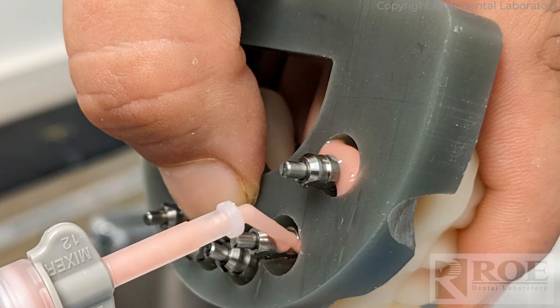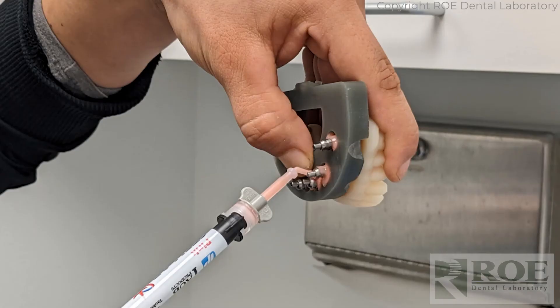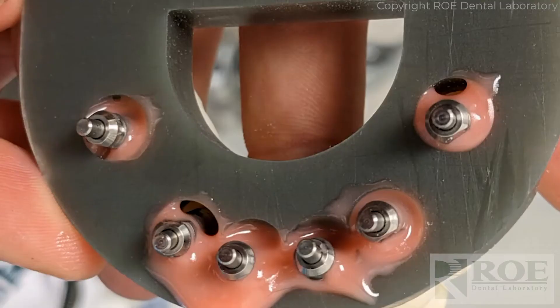With small hole technology, we take the prosthetic back to the lab, add the C2F analogs onto the prosthetic, stick them through the model, and then backfill and connect them to the model. We have lots of instructions on this process, so I'm just going to give some hints here. We make the model just like that.